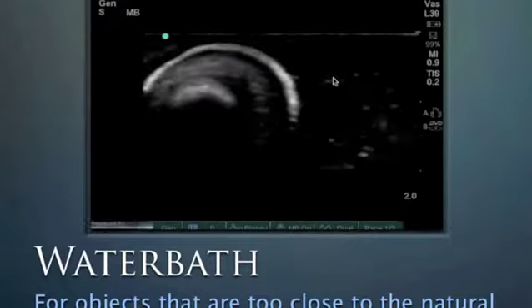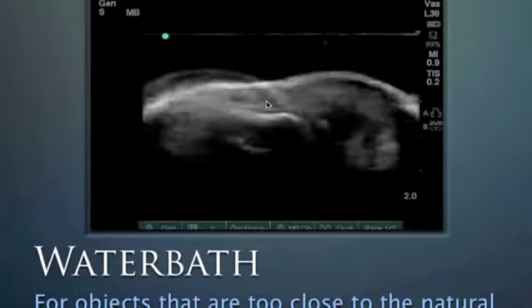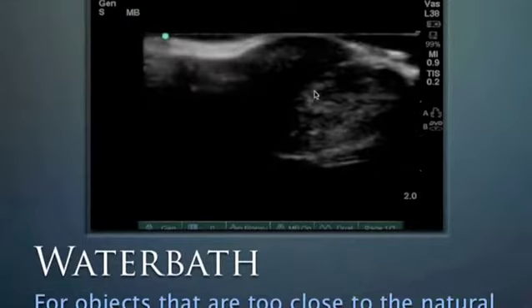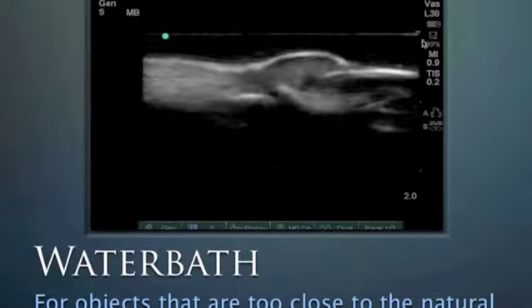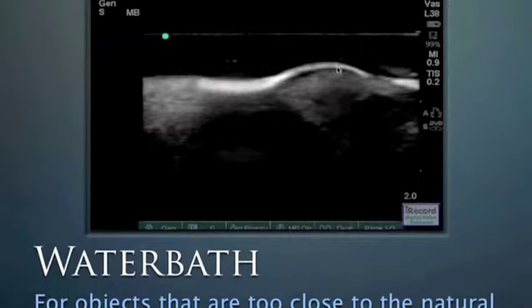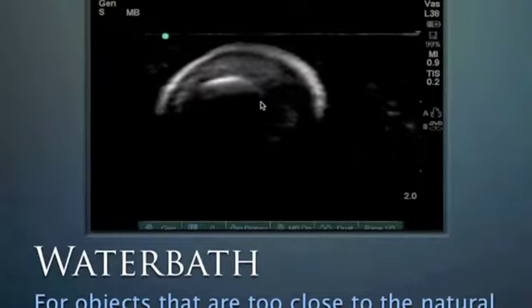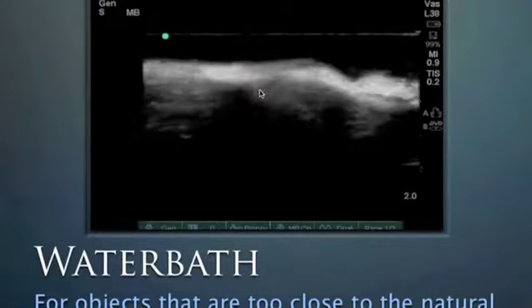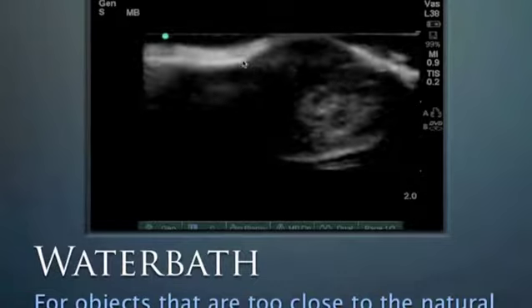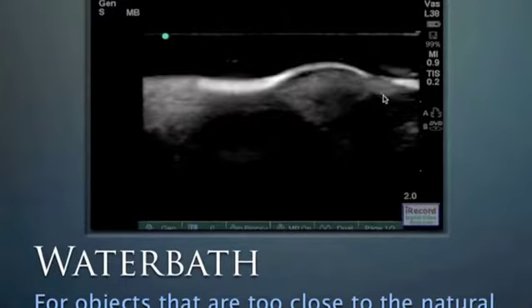Just another example of another digit. This one has a paronychia, and so it's the other aspect of the finger, and we can see that this area up here, when it's in the water, this is all water that's filling in this area here. We can make out this little paronychial area. Here it is in the short axis. We see this area here that's hypoechoic in the short axis, and then once we move into the long axis, we can see this area all under here, just right up to the nail. There's a nail bed right in there, and then the paronychia that's adjacent to it.